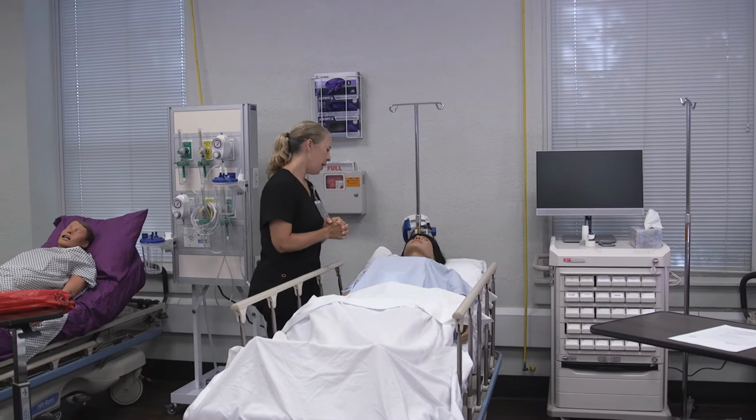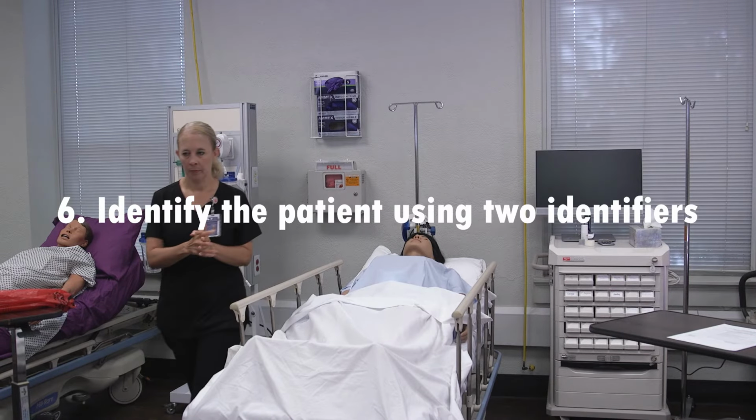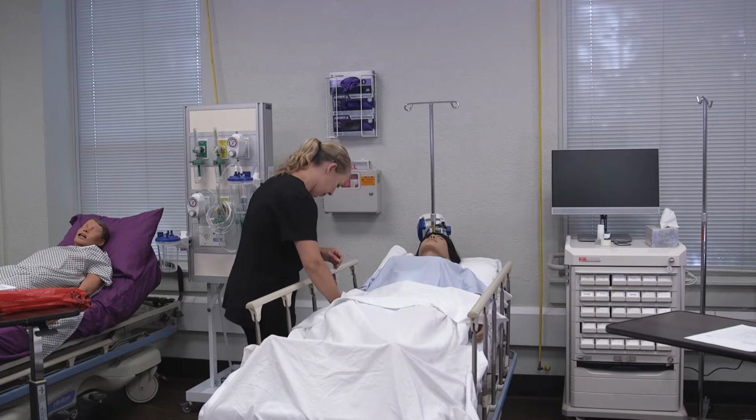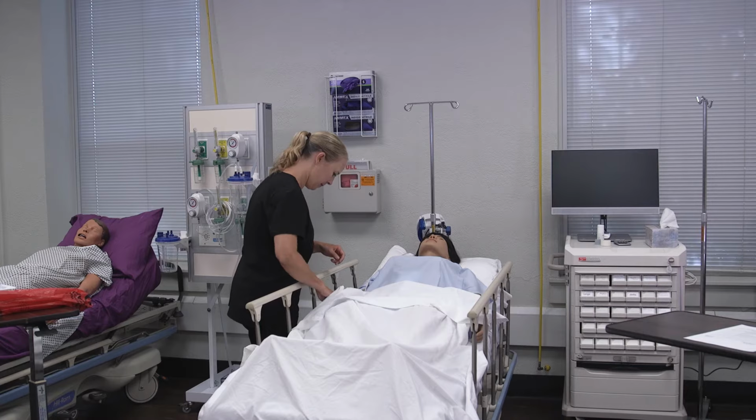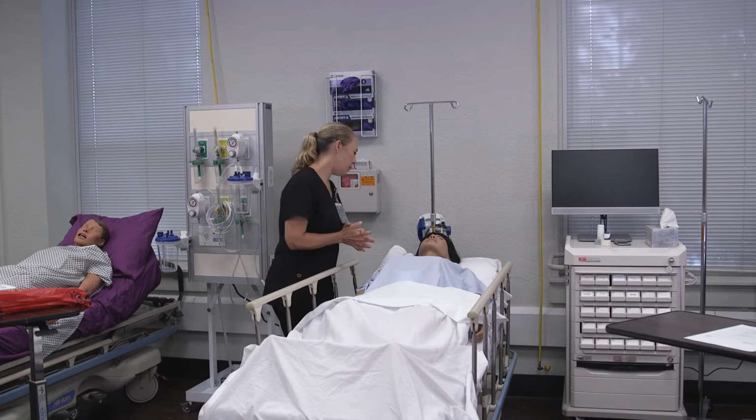Provide for privacy. I'm going to shut your door to give us a little bit more privacy, okay? Identify the patient using two identifiers. Ms. Wilkins, could you tell me your name and date of birth, please? Rebecca Wilkins, 5386. Assess allergies. Are you allergic to anything that we need to be aware of, especially any type of adhesive or any kind of medication? Not that I know of.